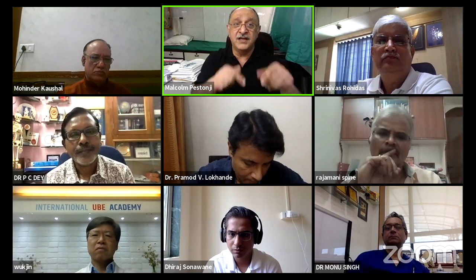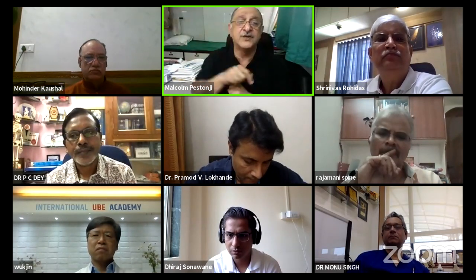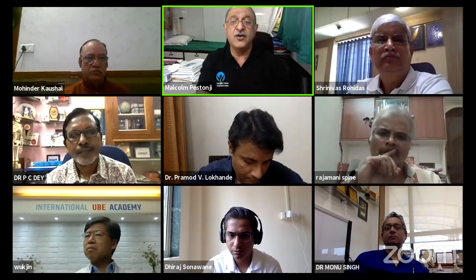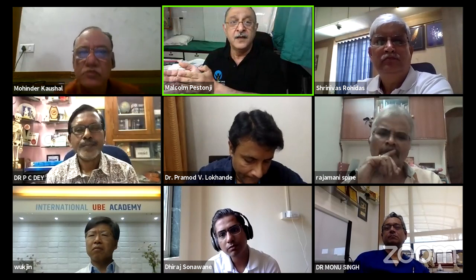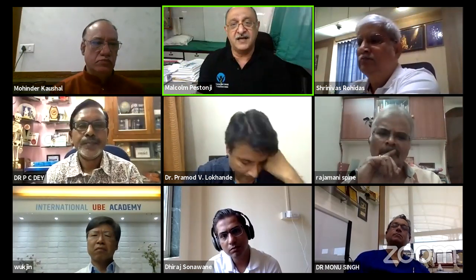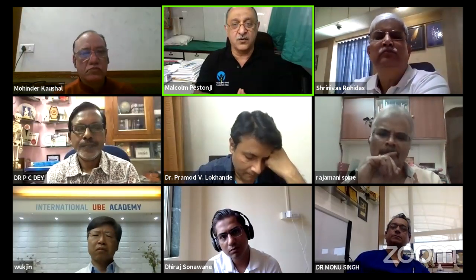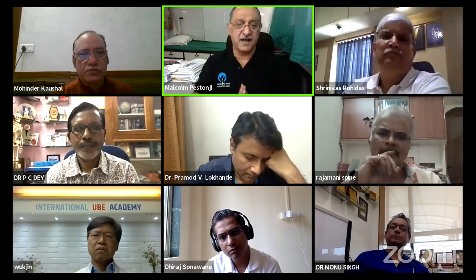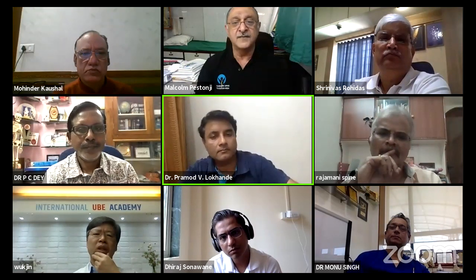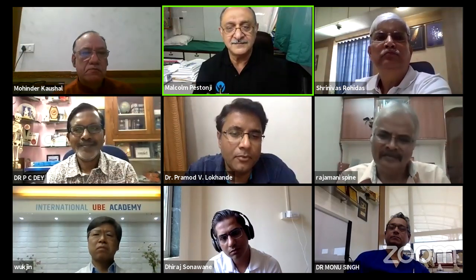But the big issue here is that you are not having independent hand movement. You are working through the scope, so there is no question of triangulation. It becomes very easy when you are switching over a technique. But if you go to a master technique or a better technique, I will say it is finally UBE, because it's a freehand technique. A 4 millimeter scope moves very easily within the spinal canal. Less chance of damage, less chance of any mishandling. Pramod may not agree. Just a few words on that.